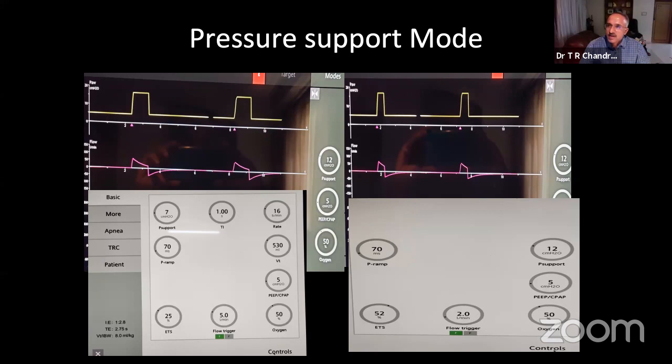Either the patient is not ready for a pressure support trial, or we have to do correction of the primary pathology, right, sir? That is the worst unscientific, unphysiological thing you can do. What you have done is you have increased the trigger to 5. What happens is the ventilator will show a lesser number of breaths, but the patient's diaphragm will start contracting more and more. So as I said yesterday, the work of breathing on a ventilator is much more than it would be without the ventilator. That's the most unphysiological thing you can do.